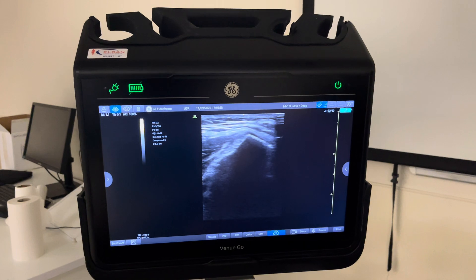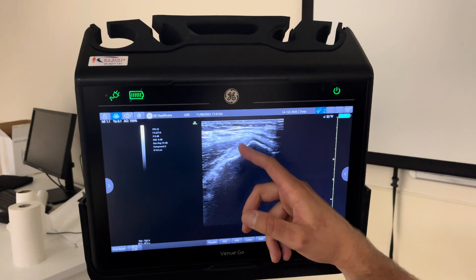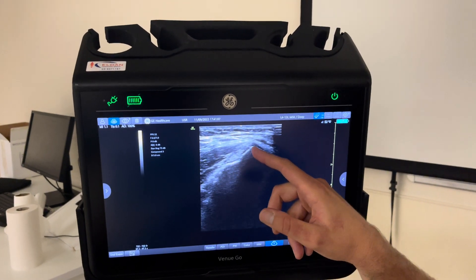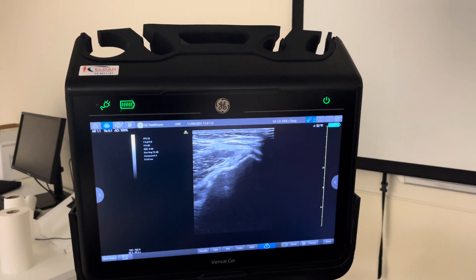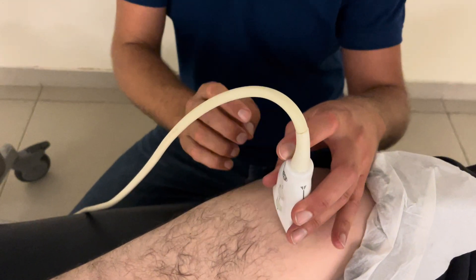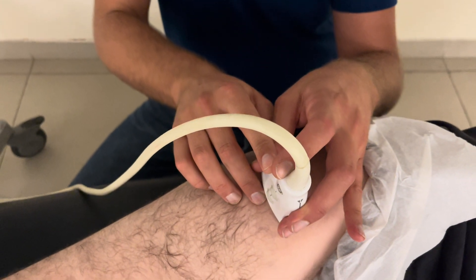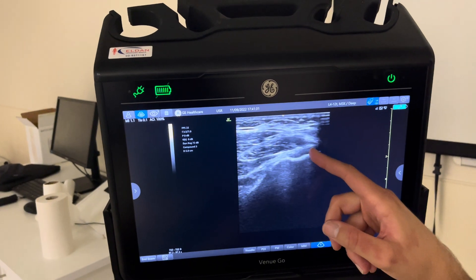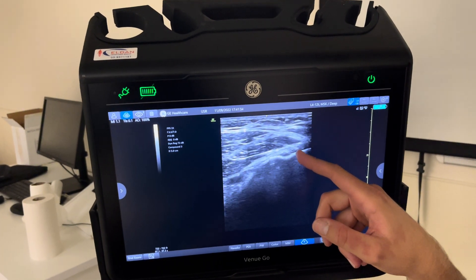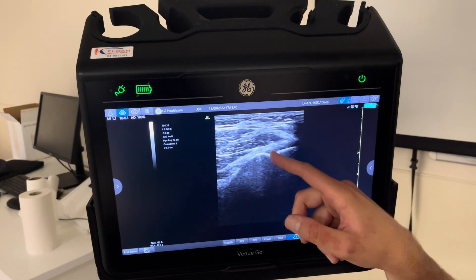Now we're going to focus on the gluteus minimus. As you can see, this is already the minimus tendon covering the whole facet. To scan it better, you have to make it as horizontal as possible, so rock the probe progressively to get a very nice flat surface of the bone. Everything covering the bone above it is all tendon. There can be a bit of anisotropy depending on the angle you scan it on. This is the image you're looking for — this is the short axis view.